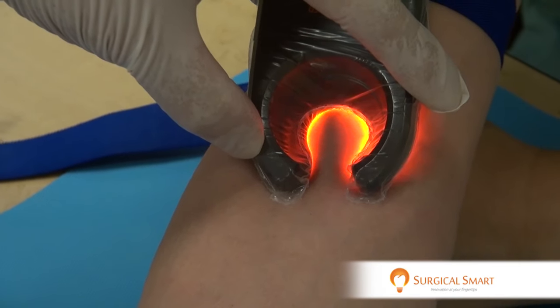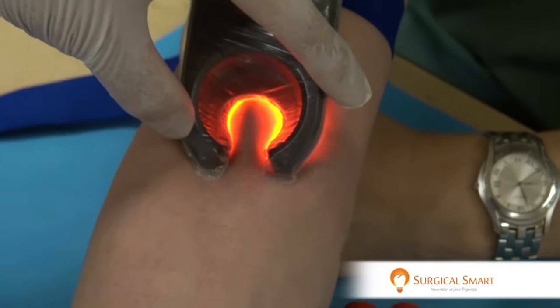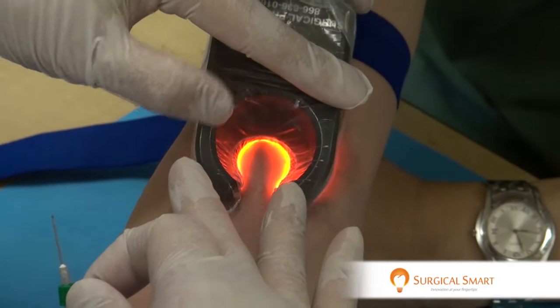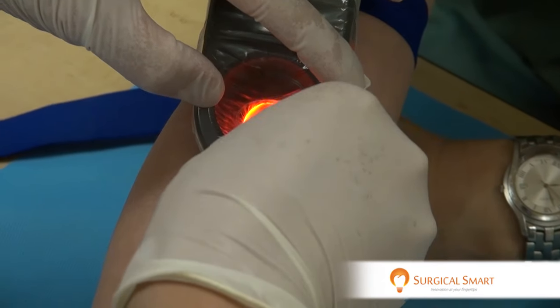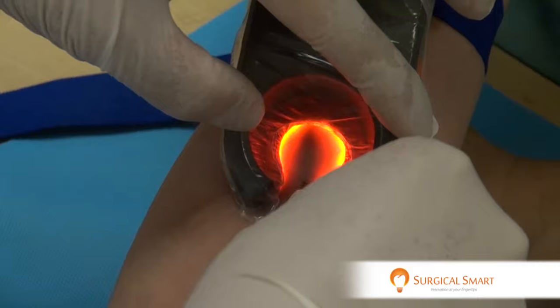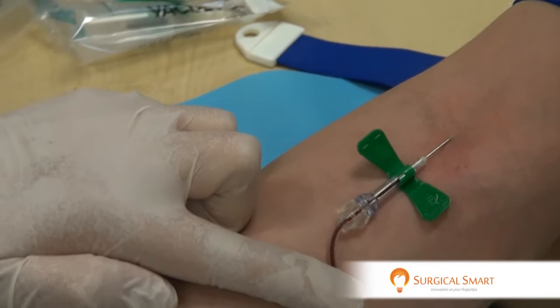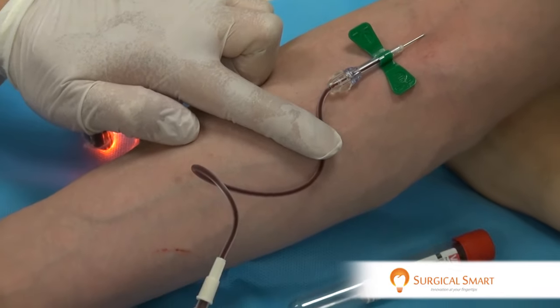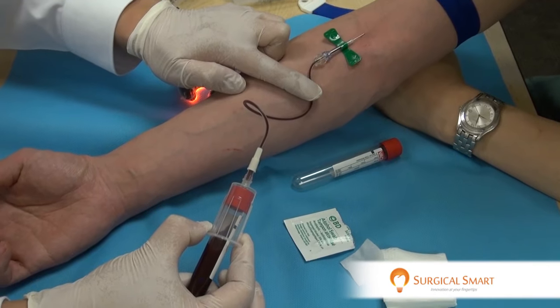And then you disinfect the site. Grab hold of your butterfly needle and perform your venipuncture per normal. Normally you would have two individuals doing this — the doctor performing the venipuncture and the assistant performing the blood draw with the vacuette. But in this scenario, it'll just be myself. Ready? One, two, three, go. And there you go. Now you can just perform the vacuette insertion and you can notice that it draws beautifully.